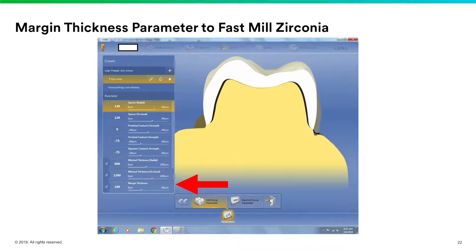Setting the margin thickness to 100 microns is imperative if you want to be able to fast mill. The reason I tell everyone to set your parameter at this from the start is: if you have it at 70 and you decide you want to fast mill and go back to change the parameter, all of the work you did on your restoration will be restarted — it reproposes the crown. So just set your parameters to 100 microns on margin thickness in general, and you'll never have to worry about fast milling — you'll always have that option.